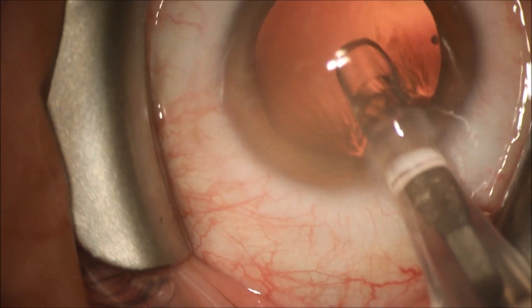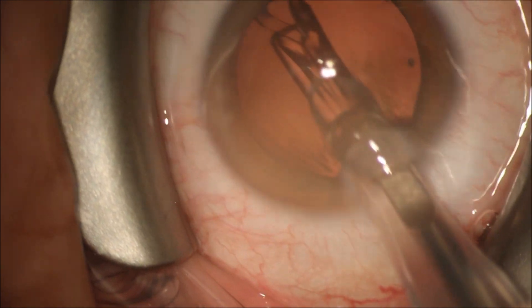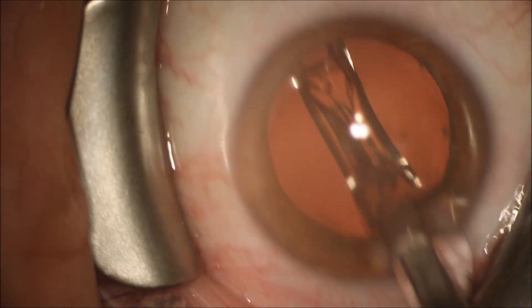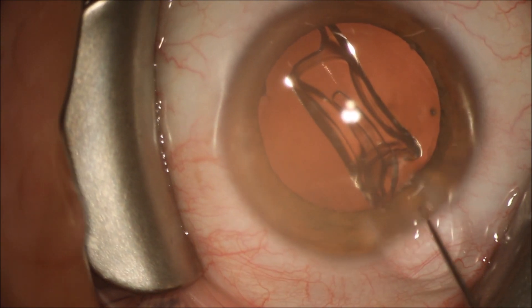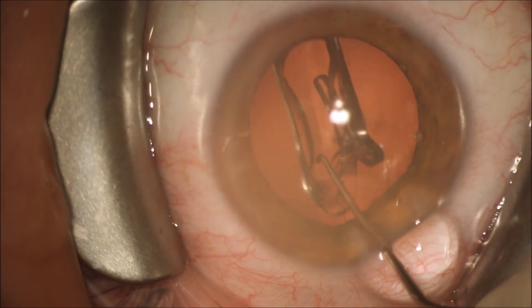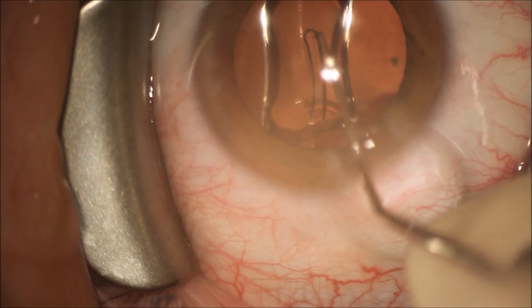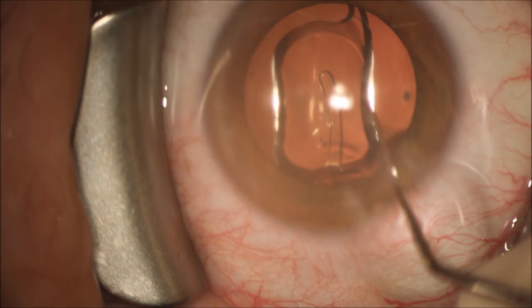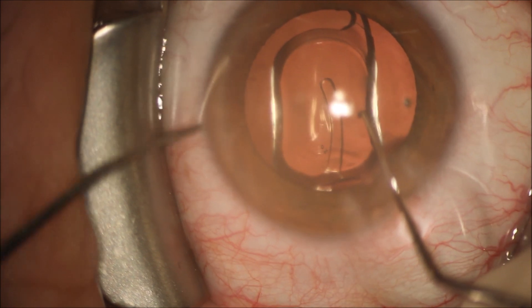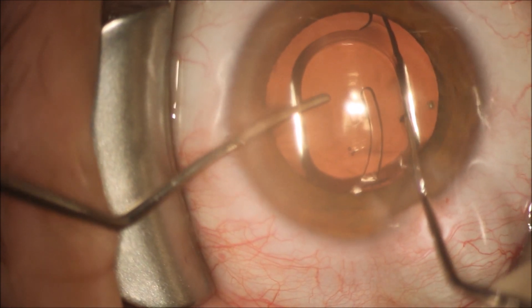This is a diffractive optic multifocal lens that I've found to be excellent for distance, near, and intermediate vision in patients we've implanted this lens into. You can see the lens unfolding. These acrylic lenses unfold slower than the silicone lenses you'll see in my other cataract cases, and this material has a more controlled unfolding.